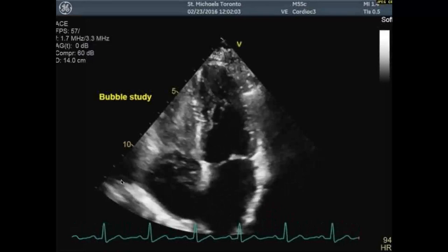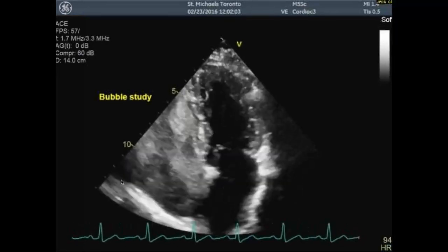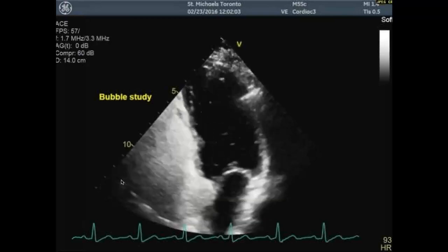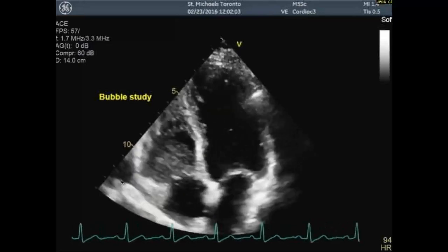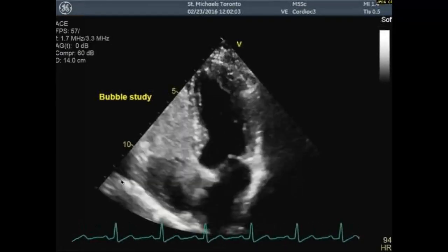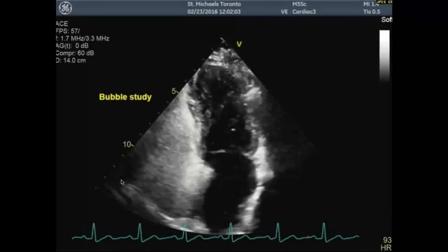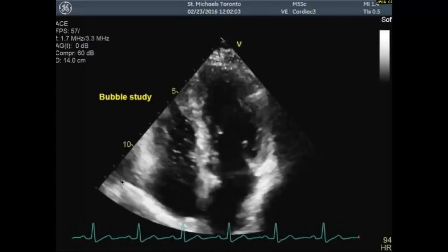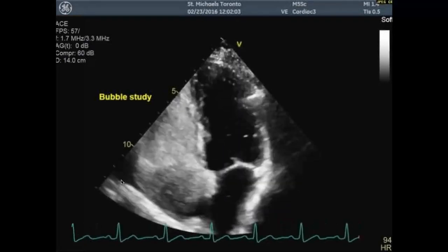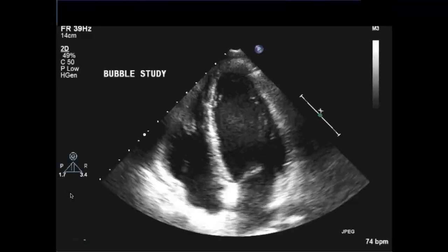Here's an agitated saline contrast study — an early positive study. Probably within two cardiac cycles you see what I would call a puff of contrast, a puff of bubbles, appearing in the left atrium — almost appearing to come from the interatrial septum. Localization of shunting with agitated saline contrast is much better performed on TEE than with transthoracic; sometimes we can be fooled about whether something is coming through a pulmonary vein. This early, intermittent pattern — one to two cardiac cycles — is much more likely to be an interatrial shunt, with PFO being the most likely diagnosis.